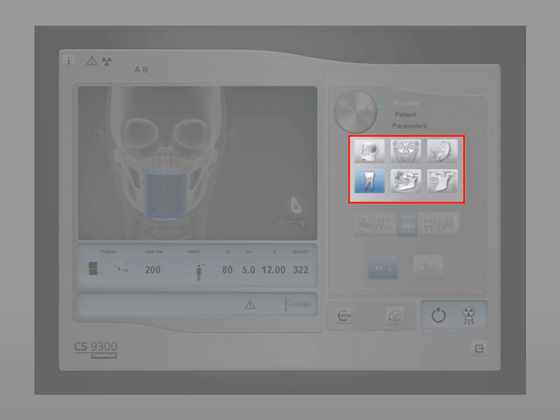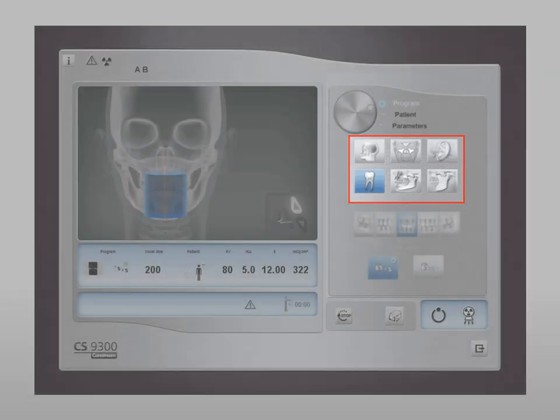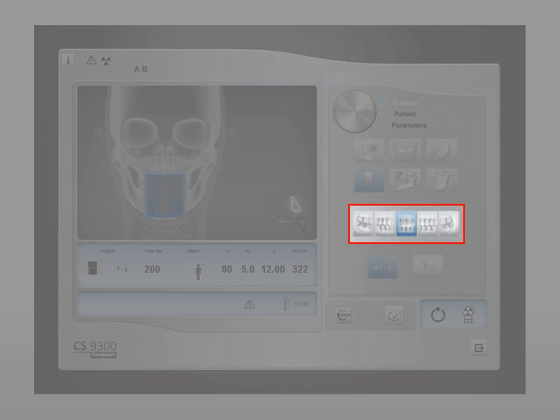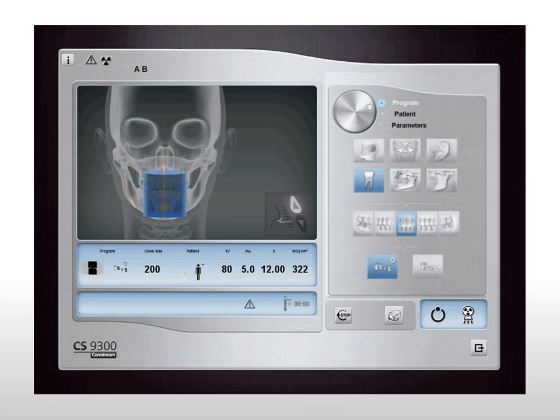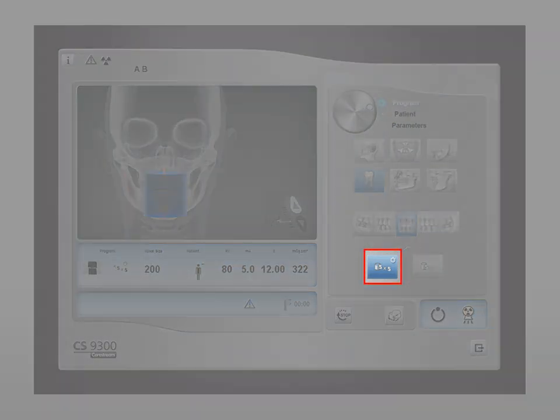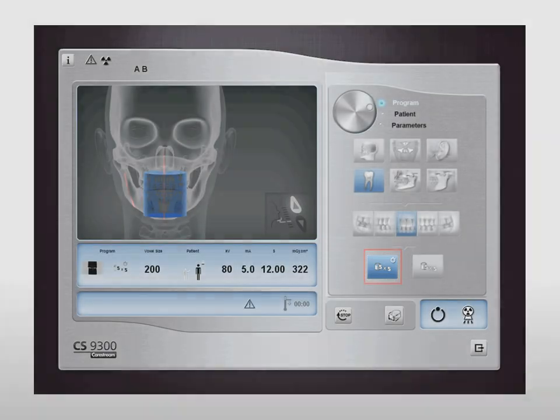Begin by selecting the teeth focus program pane option. Next, select the anterior teeth to be included in the exam. The upper and lower jaw have the same setting and are designated during patient positioning. Then select the 5x5 fast acquisition button, which minimizes the acquisition time to help avoid patient movement.